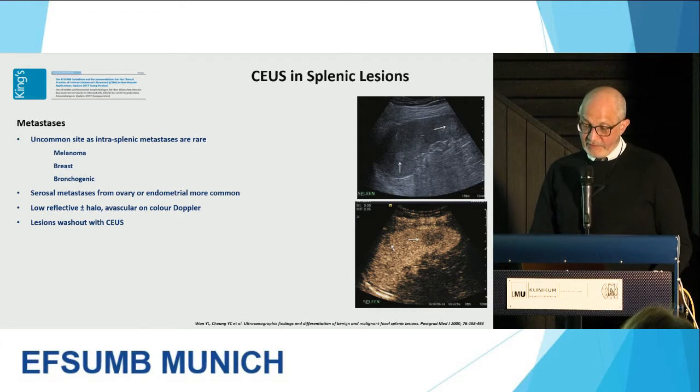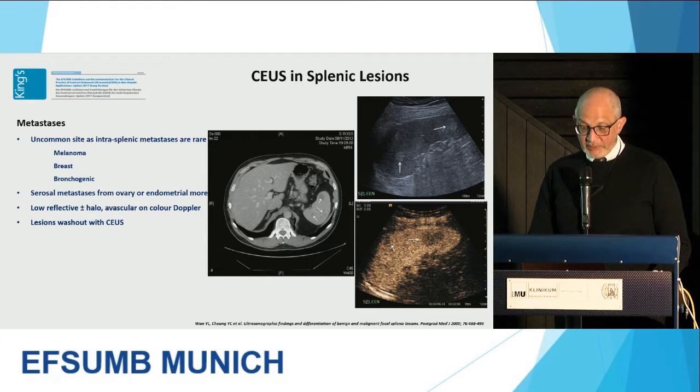And these are other views of metastases within the spleen. And this correlates with your CT examination, but clearly you see these very much better on your contrast-enhanced ultrasound, and you can observe it dynamically.